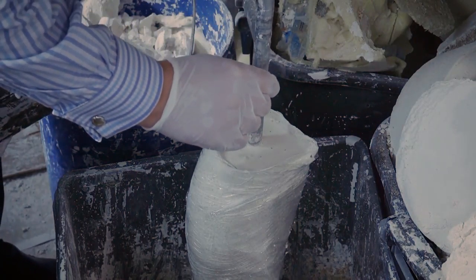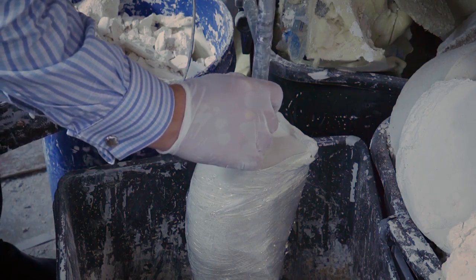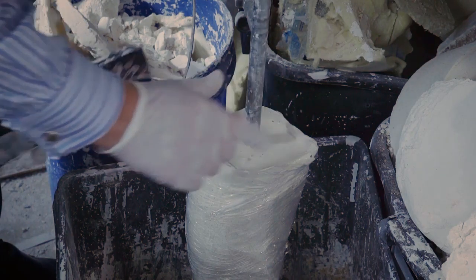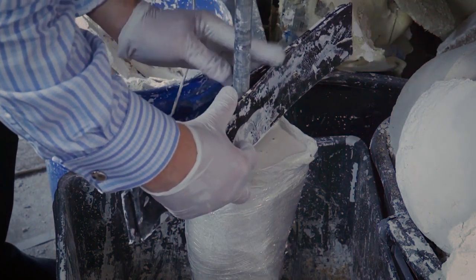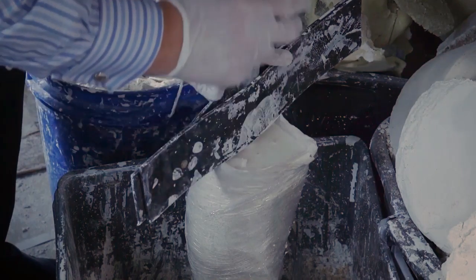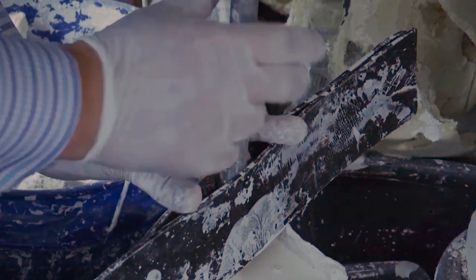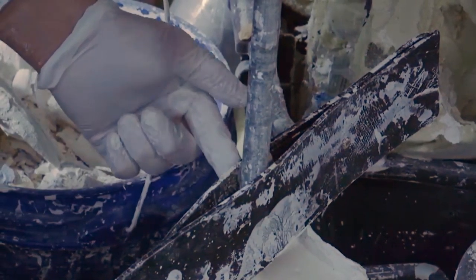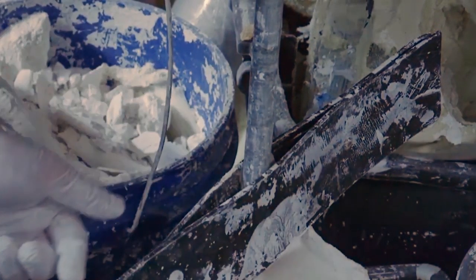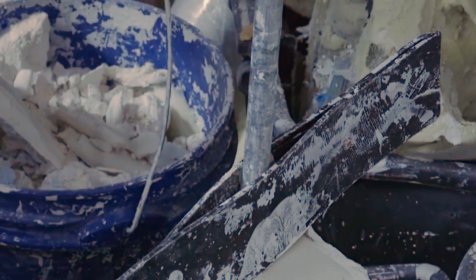Instead of a person sitting here holding the conduit pipe in the right position — just an inch off the bottom — you can use a tool like this. When you're ready, press down, feel the bottom of the cast, then bring it up an inch. We can walk away and come back later and it'll be all set. I'll fill in a little bit of capping, and there we go.